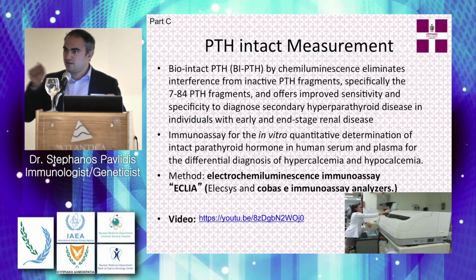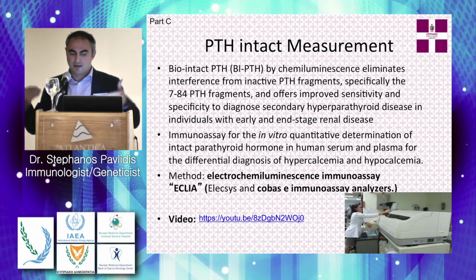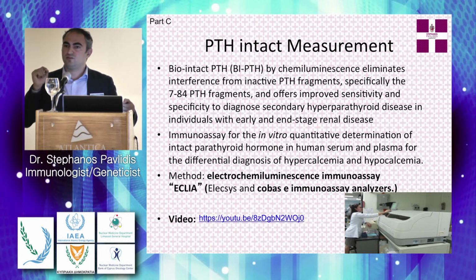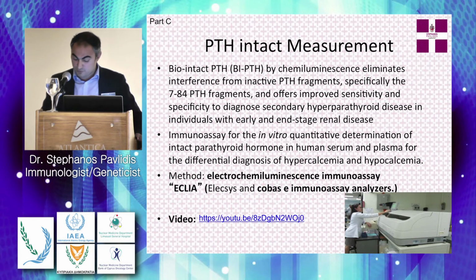And I will explain in the next slides how this specificity on the first amino acids can improve the sensitivity and specificity, due to the fact that the previous tests were recognizing amino acids after the first seven amino acids. I'm going to show you a picture which gives you a very good idea of how it works.